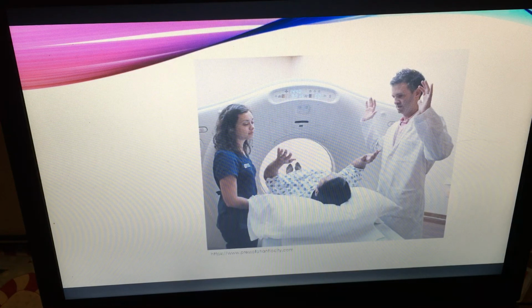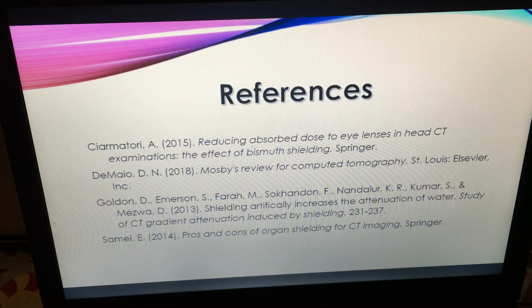After speaking with fellow coworkers, I have learned that many CT techs do not utilize shielding as much as they should. They explained it slows down the process or causes artifact, which may require a repeat scan without the shield. I think this is a process that needs to be more consistent if we hope to reduce patient exposure to radiation in the future.